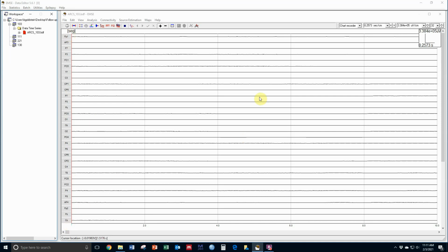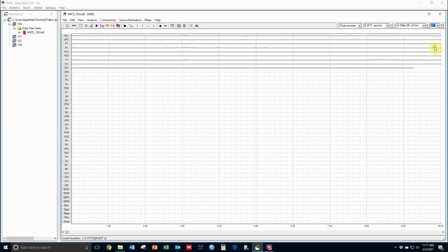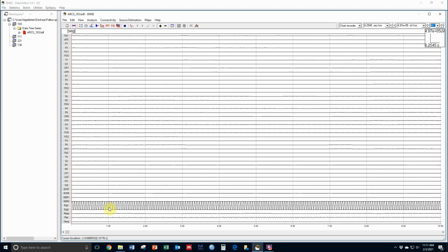This is everything that's the EEG channels, but we can see more. So if we go over to this thing that says 32, that's showing us the 32 channels from the cap, but we can say, let's show us all 47 channels of stuff that you've got recorded. And now you're going to see over here, we've got the mastoids, the eye channels, the heart rate channel for EXG7, skin conductance, respiration, all kinds of good stuff. Now, not all of these have useful information in it, and we're actually going to turn most of this stuff off to make it easier to see what we're doing because this isn't scaled in a way that's at all useful.